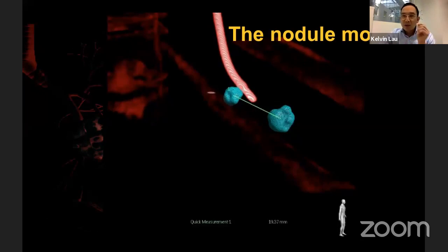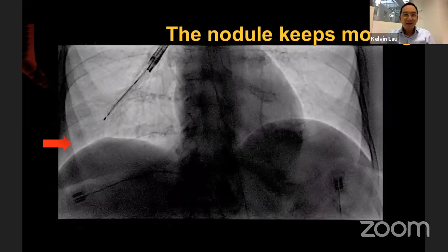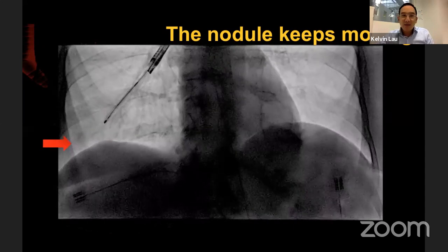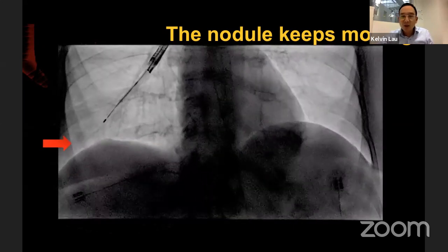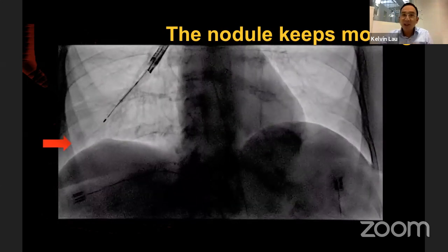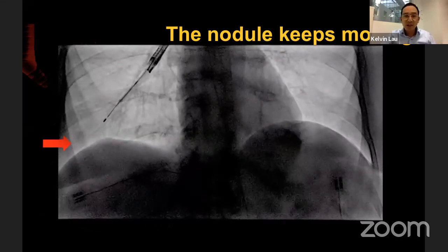So this is not taken into account when you do your conventional bronchoscopy. You need something to show you where the nodule is when you're doing the bronchoscopy, rather than making an assumption about yesterday. The other thing is the nodules move with breathing. Here you can see, if you look at this nodule where the arrow is pointing, an 8 millimeter nodule can easily move its diameter or more than its diameter. So you will completely lose your position if you make the assumption that the lesion is where it is when you're fully inspired.